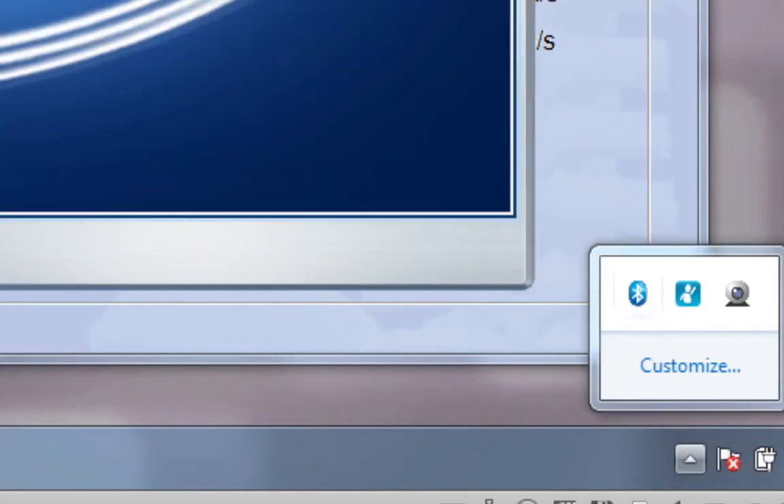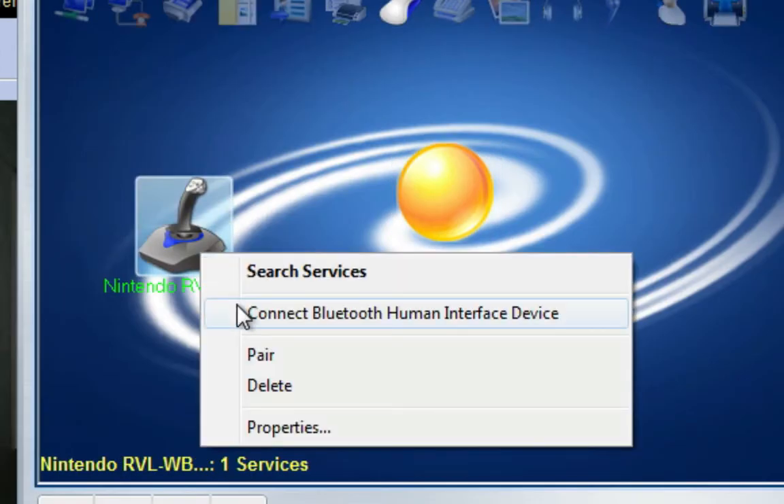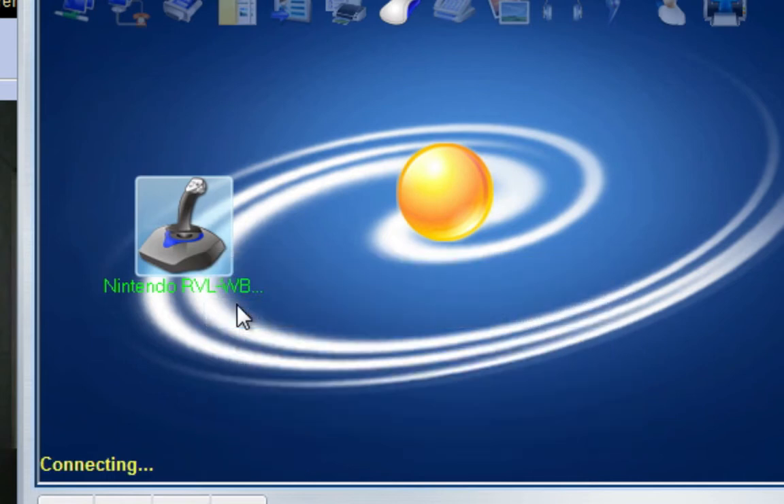Double-click on the Bluetooth icon. Right-click on the joystick icon and choose Connect to Bluetooth Human Interface Device, while holding the red sync button on your balance board.